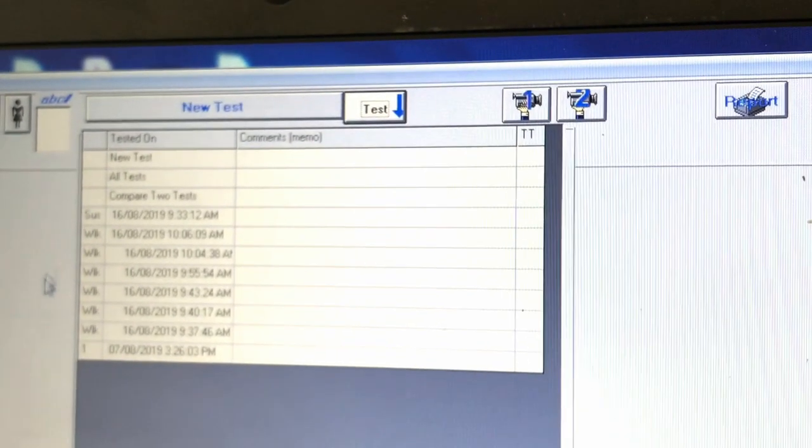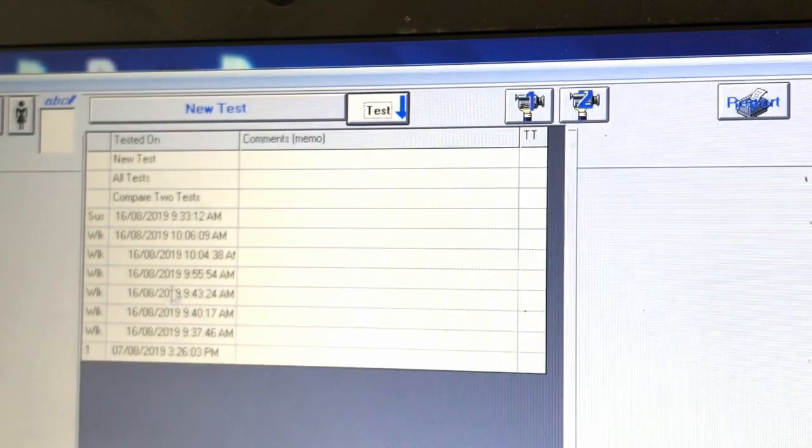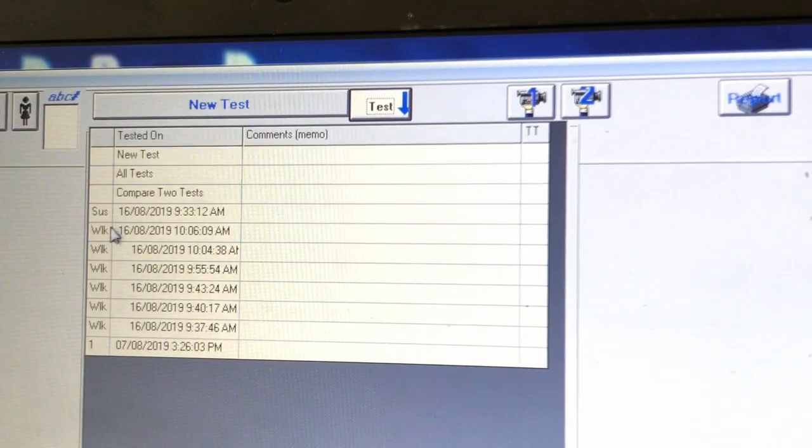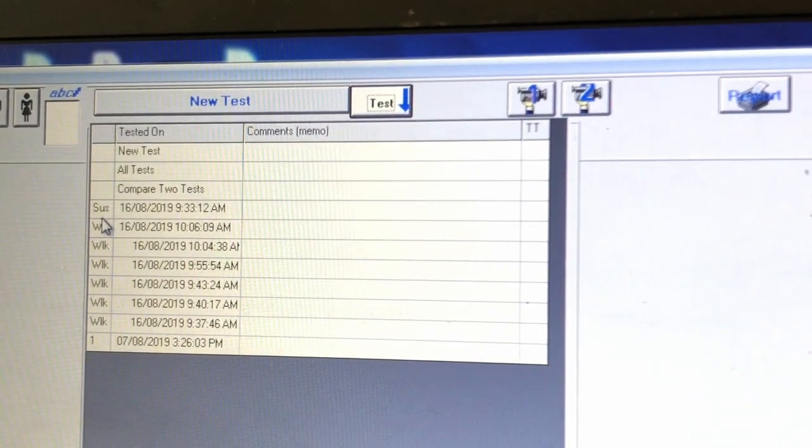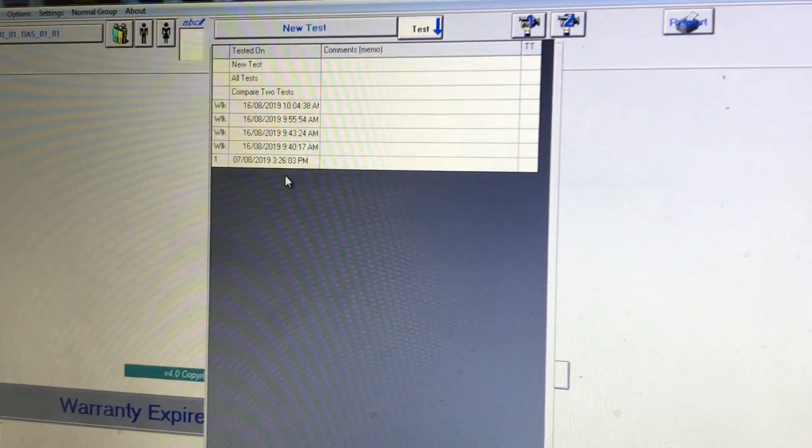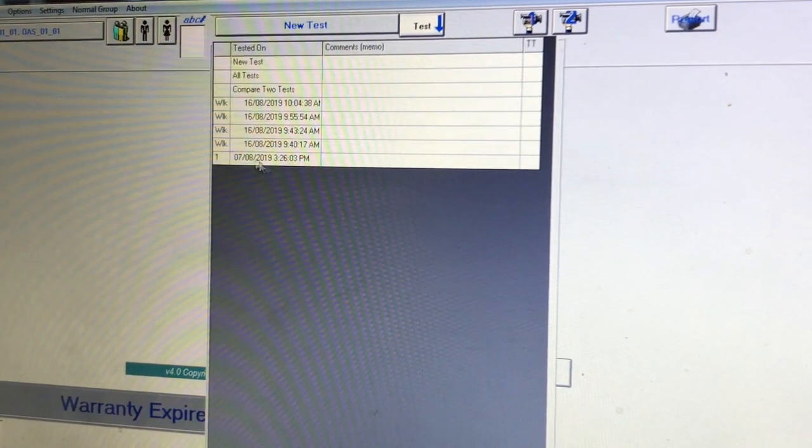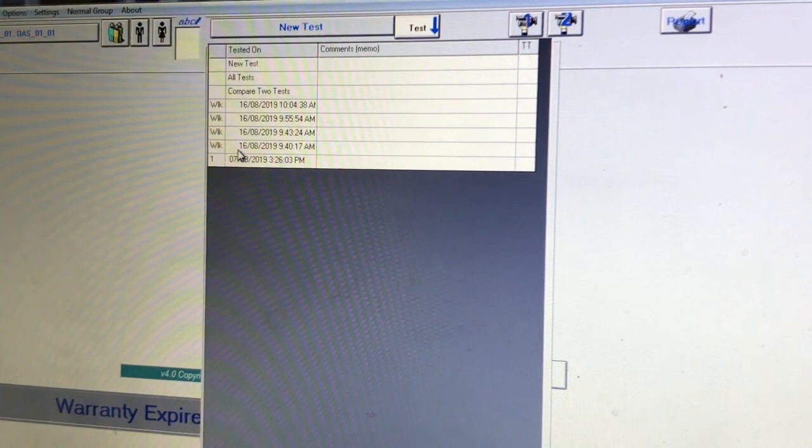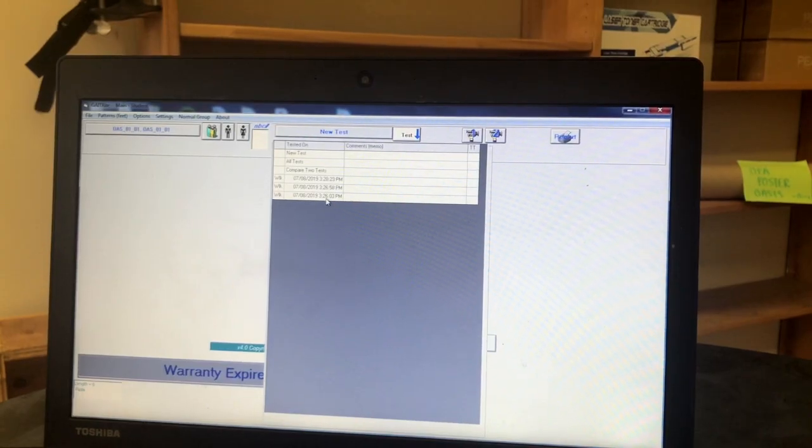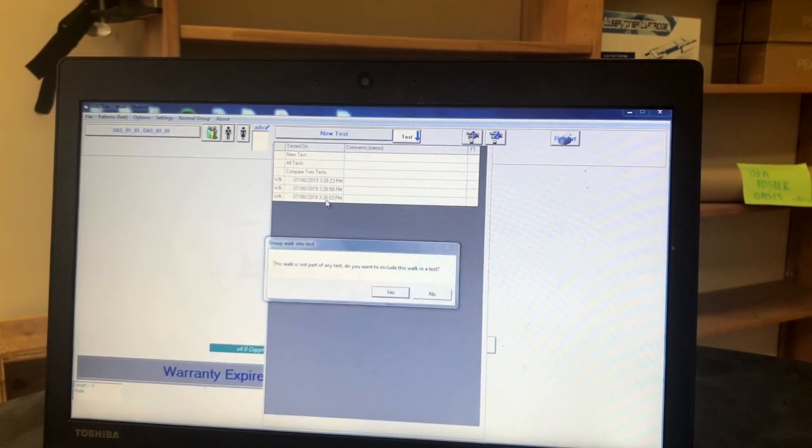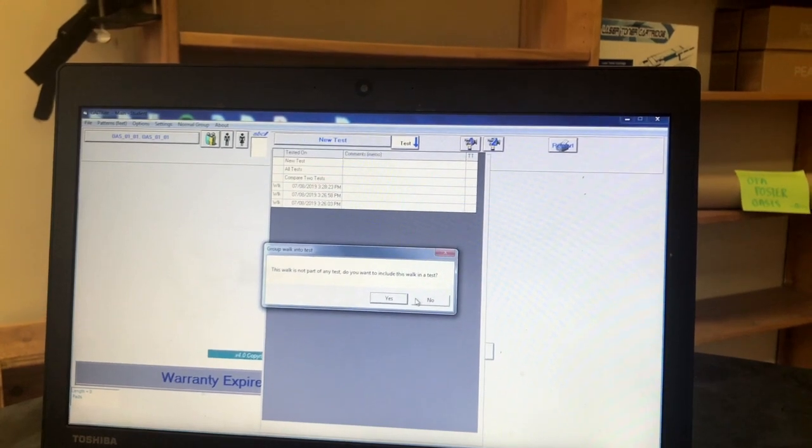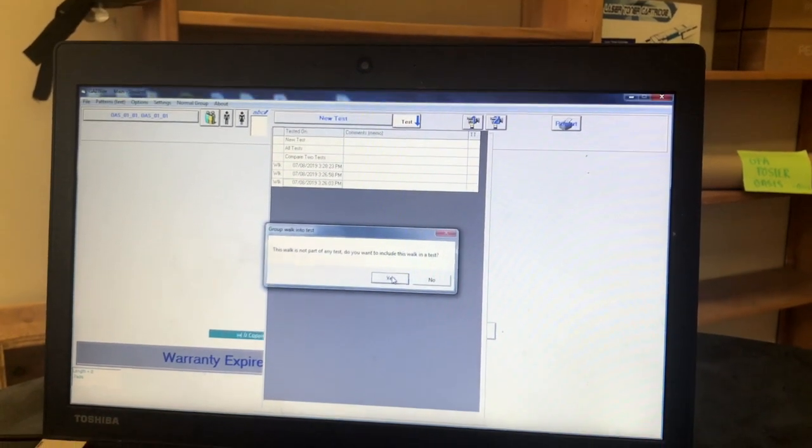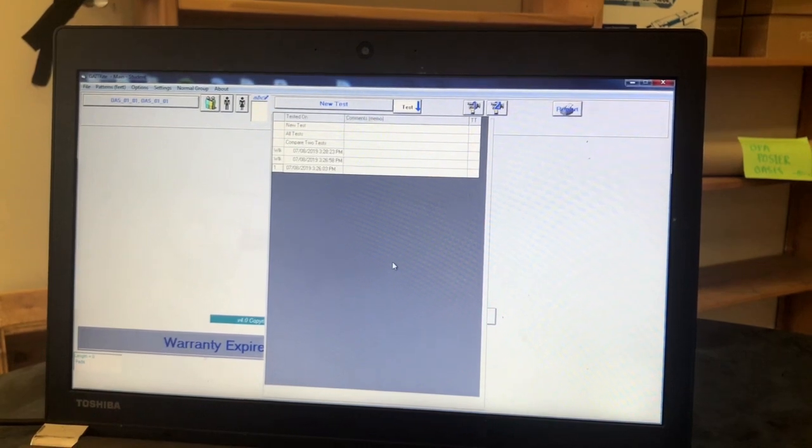Once all of your suspended walks are fixed, check out the troubleshooting video for advice on how to fix these. The drop-down menu of all your trials should just have WLK shown beside them and you can now make a test. To do this, you start by clicking on any walk that you want to include in the test. A pop-up shall appear asking, this walk is not part of any test. Do you want to include this walk in a test? Click yes.